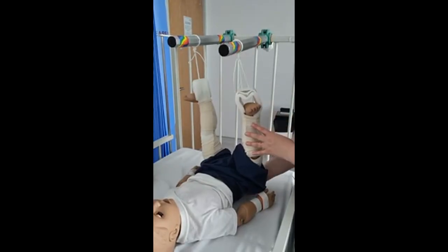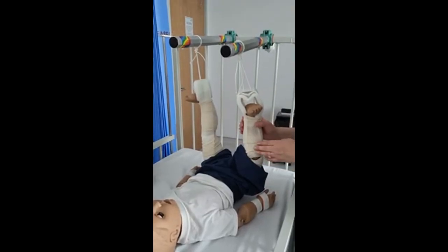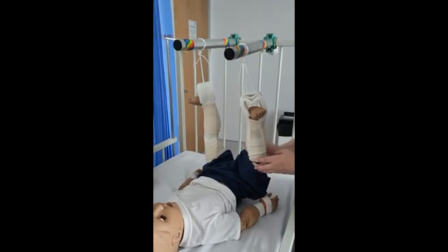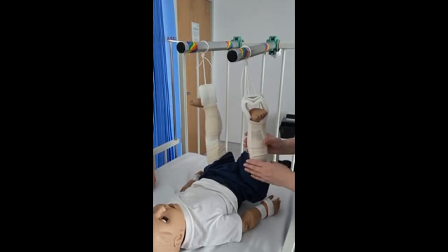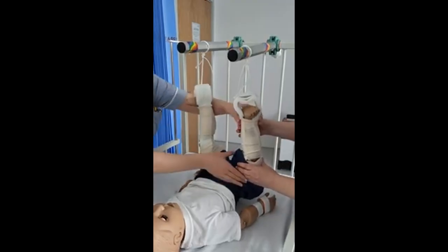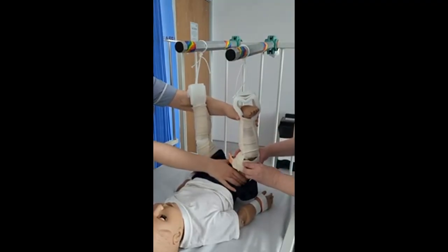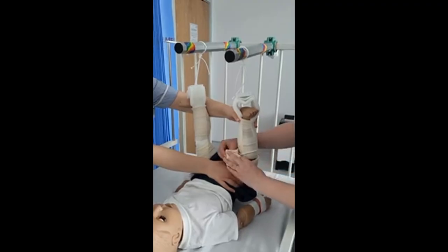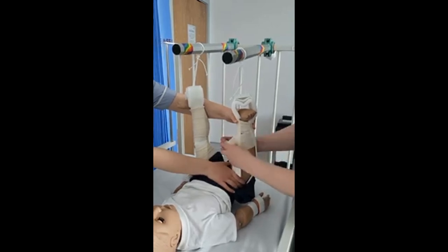If the knots slip, or the bottom is touching the bed, or the bandages are coming loose, you need to be changing them straight away. Otherwise it's something you can do once a day. Give pain relief before you take the bandages down, make sure the child is comfortable and the parent and child are aware of what's going to happen. Then with another person present, ask your colleague to support the limb. Remove the tape, and if you're using non-adhesive traction you have to be really careful that it doesn't all slip off when you start to unbandage — a really good tight supportive hold. Maybe use a play team to distract the child and keep them occupied while you remove the bandages.